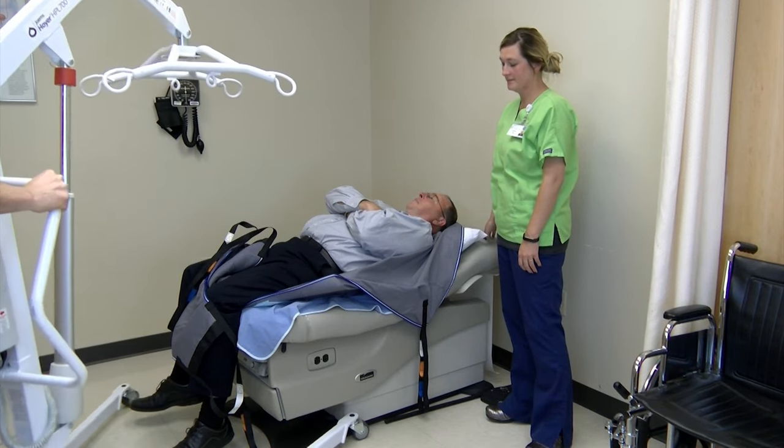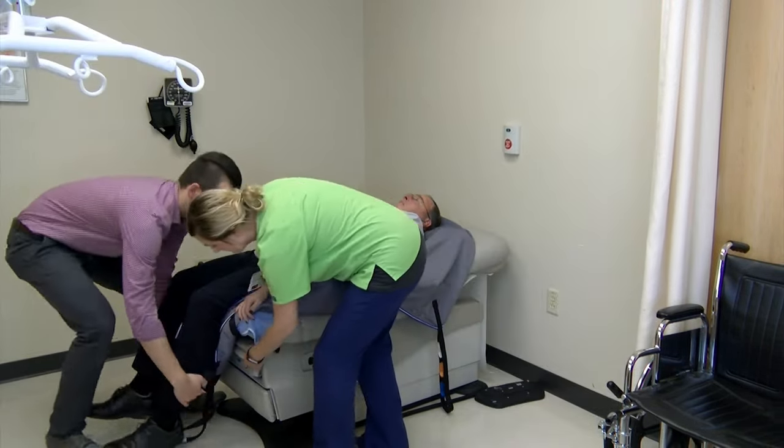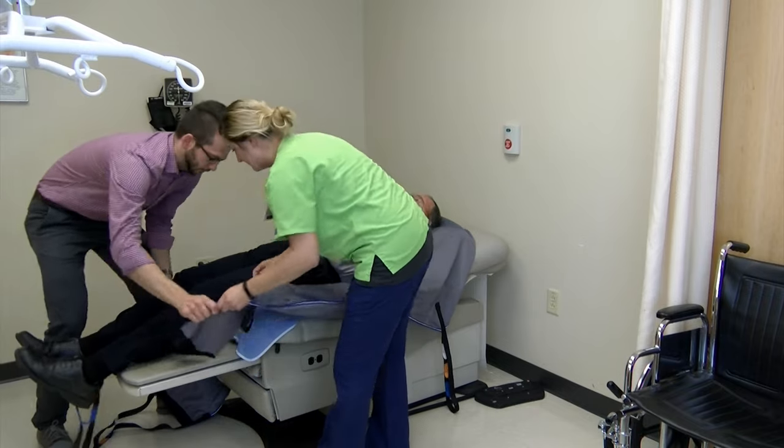Unlock the rear casters and remove the lift. Then remove the sling from underneath the patient.